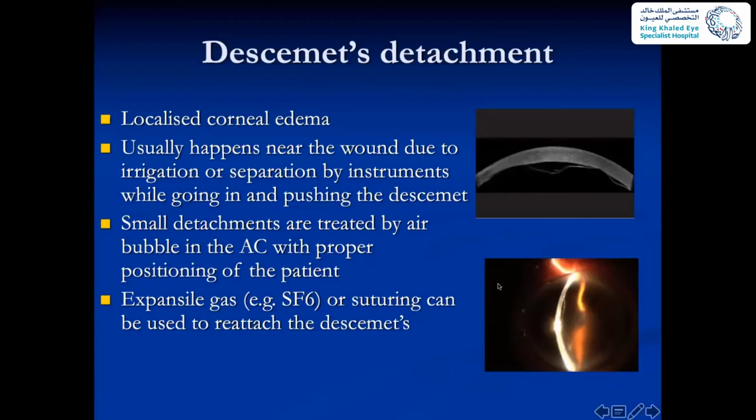How to diagnose Descemet detachment? We can see it in the slit lamp together with the edema. Sometimes you have edema that you cannot see beyond, so you have to do OCT or UBM, or put in some dehydrating drops before you can examine, see and diagnose Descemet detachment.